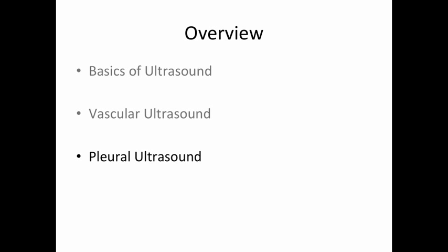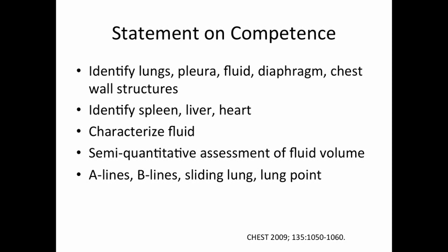And that will sort of lead into pleural ultrasound, which I'll try to touch on briefly as well. And so again, the statement on competence here tells you that you should be able to identify the structures that you're looking at, of course, right? That includes both the lung as well as the pleural space, but also the structures that surround it.